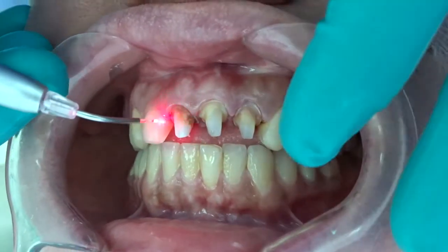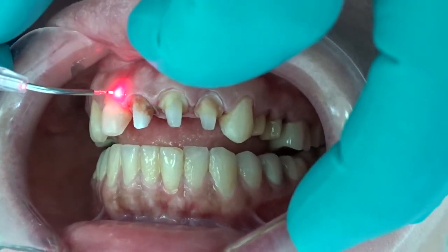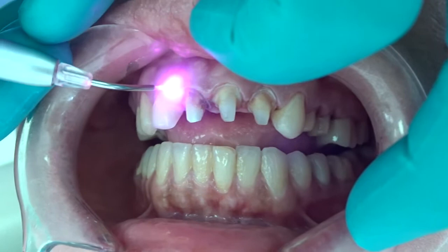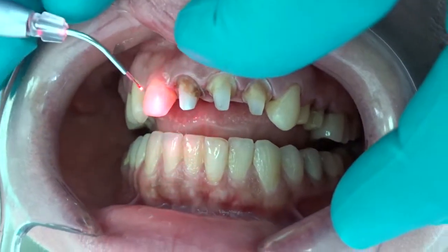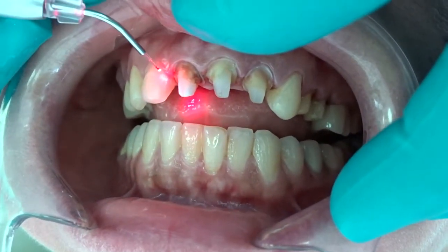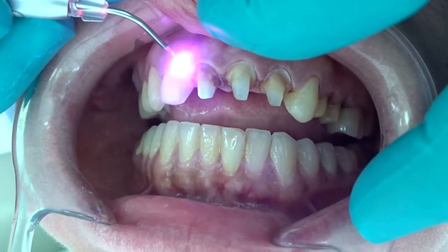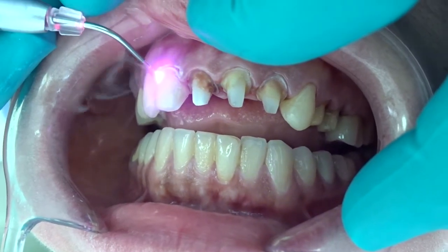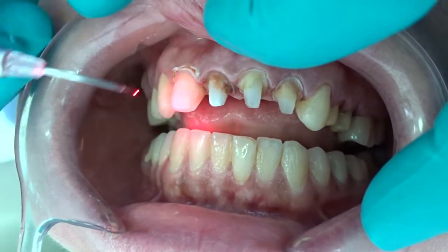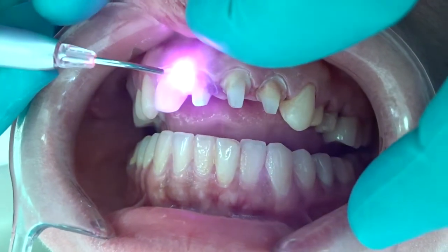Hello, I'm Dr. Mohamed Rifai. Today we will speak about laser technology. This device is a diode laser from Biolaze. Its name is Epic.